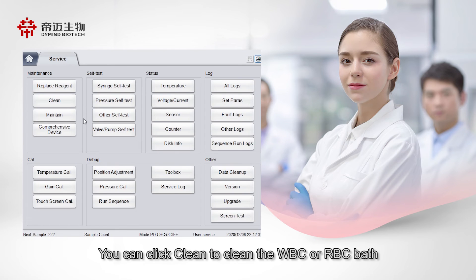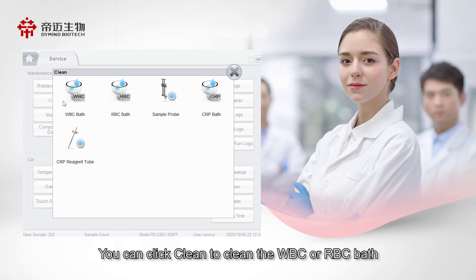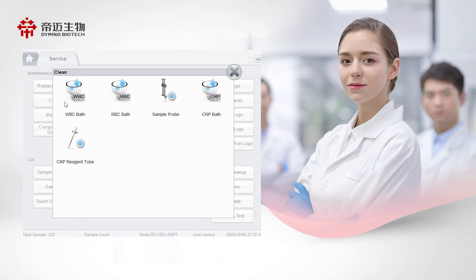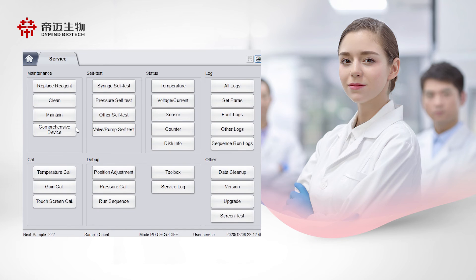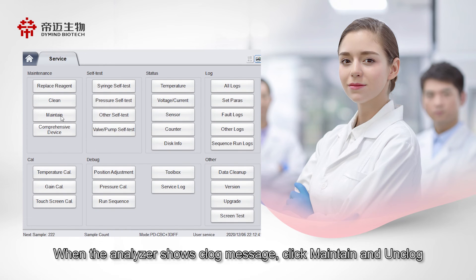You can click Clean to clean the WBC or RBC bath. When the analyzer shows a clog message, click Maintain and then Unclog.